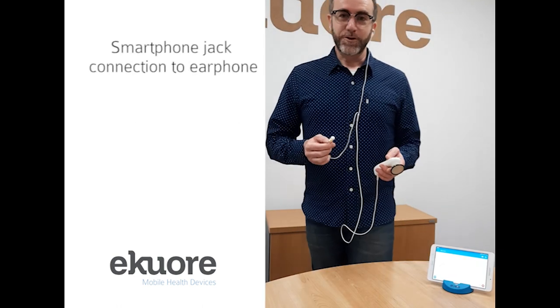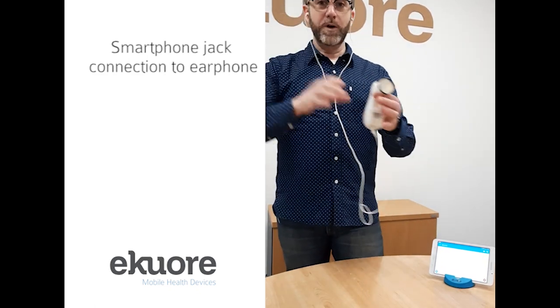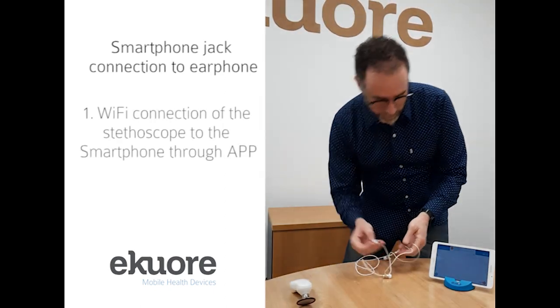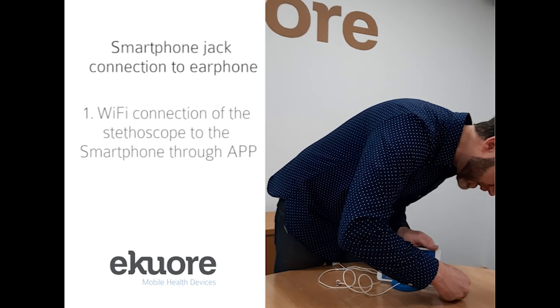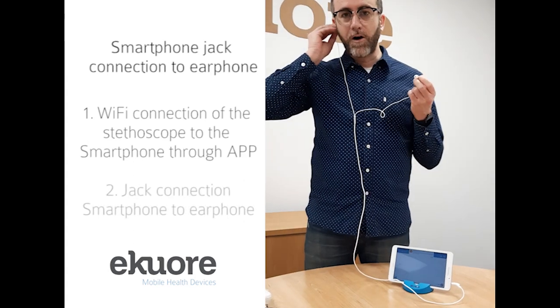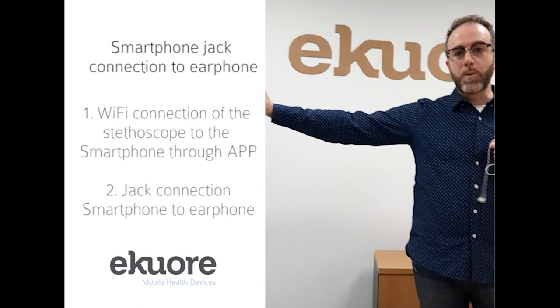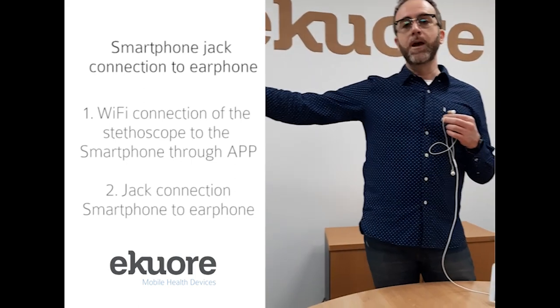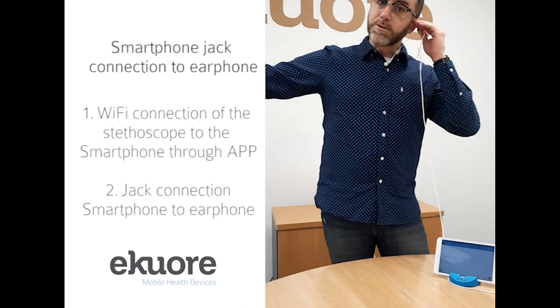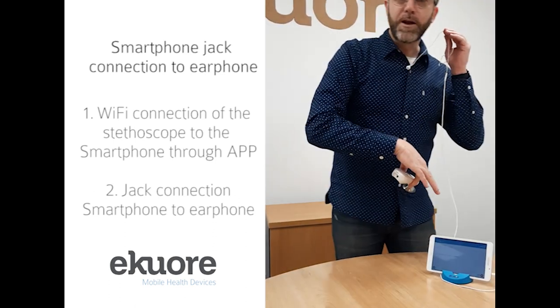To listen to these auscultations via our EqualPRO app, normally we go this way to make all those auscultations. But what we will do to avoid the risk of contagion is just place the earbuds or the headset on the mobile device and leave the stethoscope for the patient or the nurse who is doing the auscultation from an isolated room. We could then listen to the auscultation in real time through the EqualPRO app while it is being recorded.